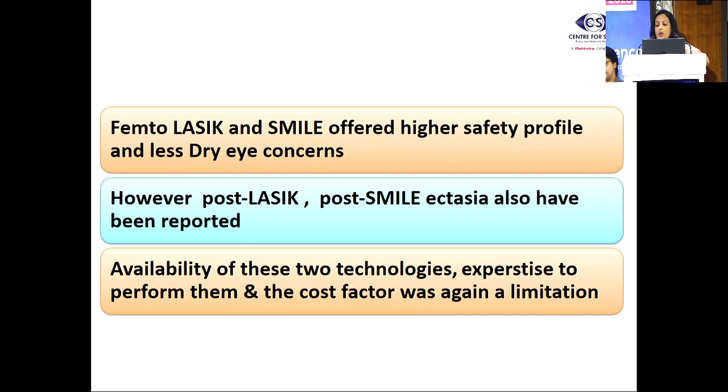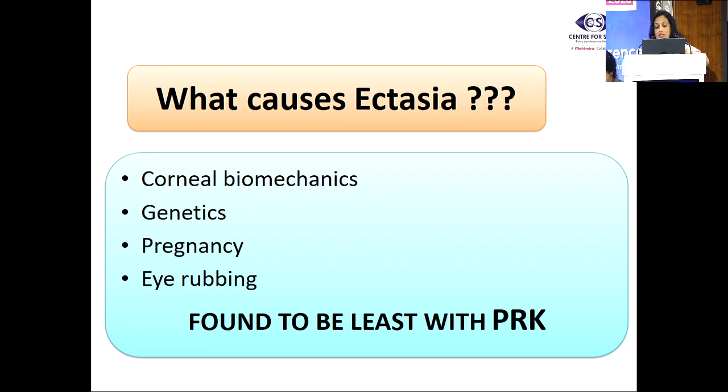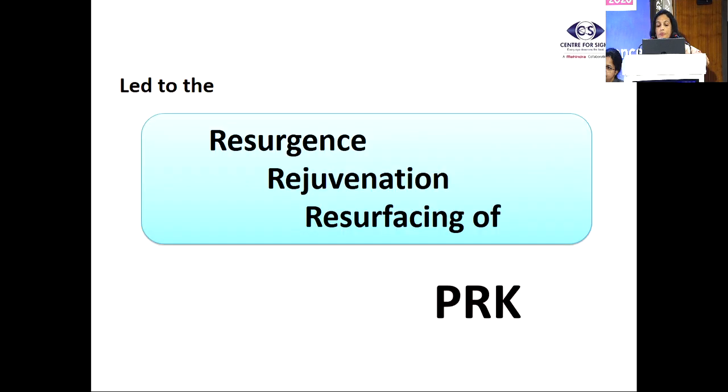Femto-LASIK as well as SMILE offered a higher safety profile and fewer dry eye concerns. However, post-LASIK and post-SMILE ectasia have also been reported. We also need to keep in mind the availability of these two technologies, the expertise to perform them, and the cost factor. So coming back to what causes ectasia, we don't know whether it's the corneal biomechanics, the genetics, or the hormonal level changes in pregnancy, or it could be something as simple as eye rubbing. Whatever it may be, it was found to be the least with PRK. So all these factors led to the resurgence, rejuvenation and resurfacing of PRK.